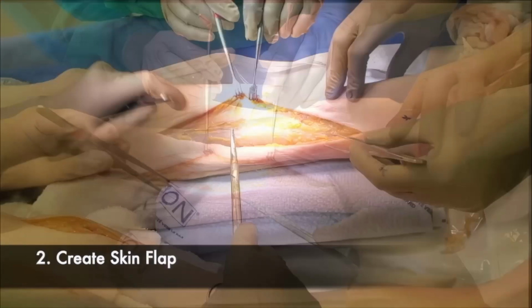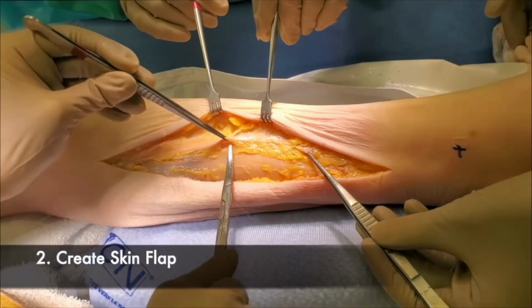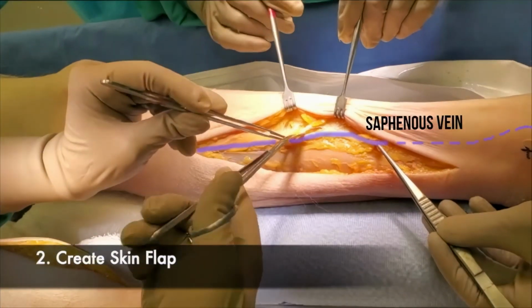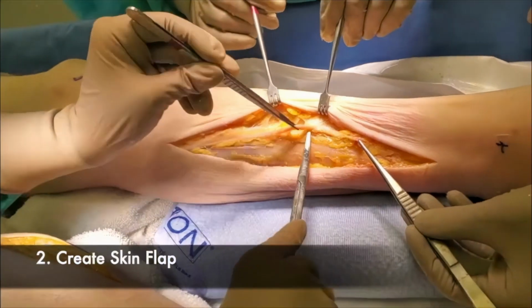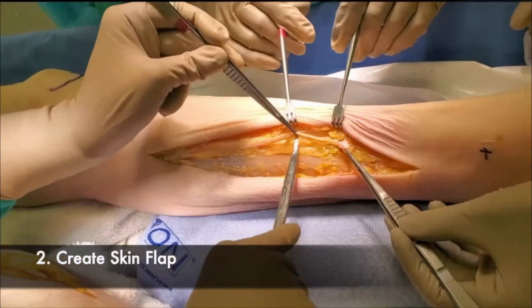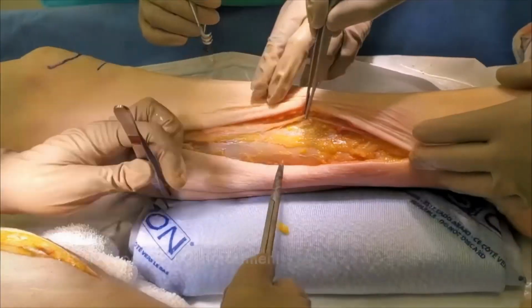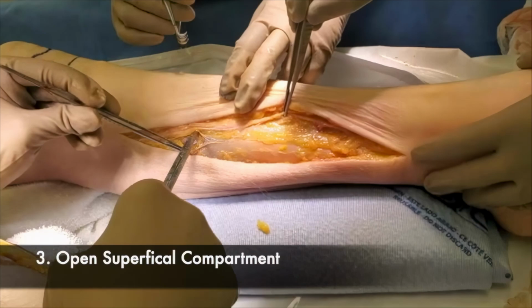Be careful not to damage the greater saphenous vein or nerve, and make sure you ligate any perforating branches of the saphenous vein, as these can be very superficial and bleed profusely. In this video, our skin incision was too short. Make sure to cut through the full length of your punctuated line. Mobilize the skin to reveal the underlying fascia.